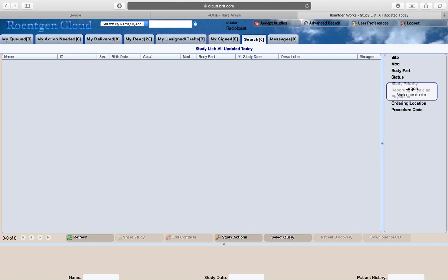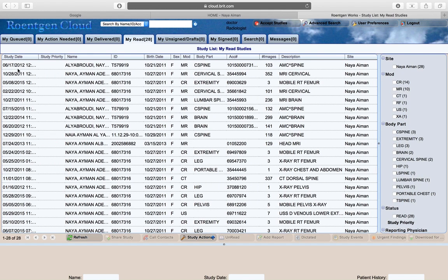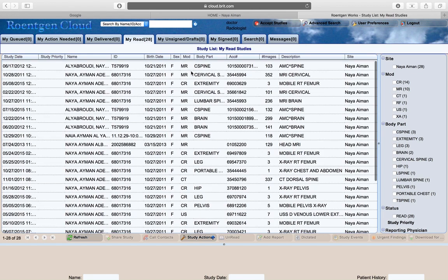the study, whether it's a CR, MR, brain, C-spine, or whatever it is. From there, you just need to double-click on the study and you'll be redirected to the images included in that study.